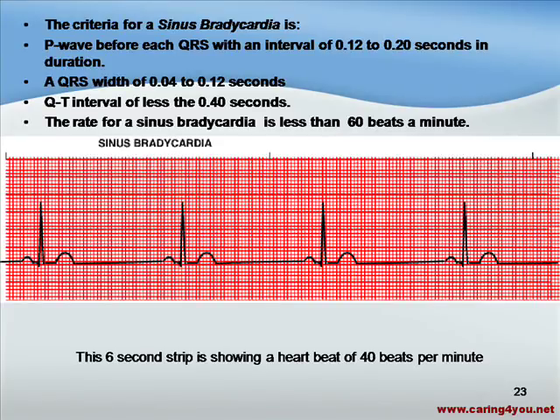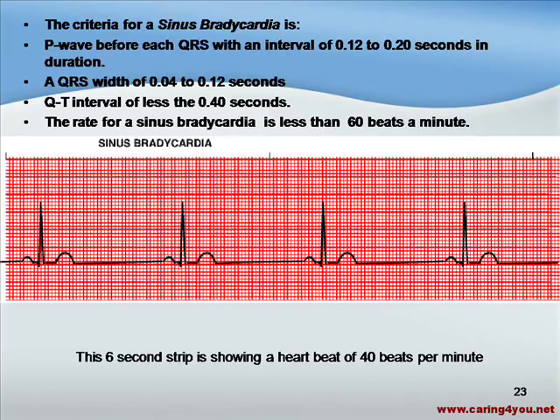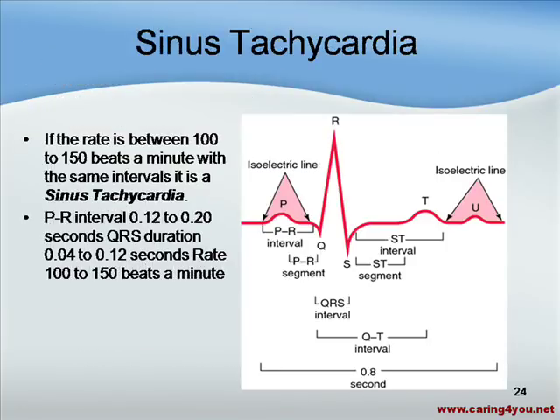This is an estimate of the rate. In a six-second strip, there are little black notches at the top. Each one of these notches represents a three-second interval, so notch to notch is three seconds. You only count what is in between these marks. In this particular example, three seconds plus three seconds makes a six-second EKG strip.